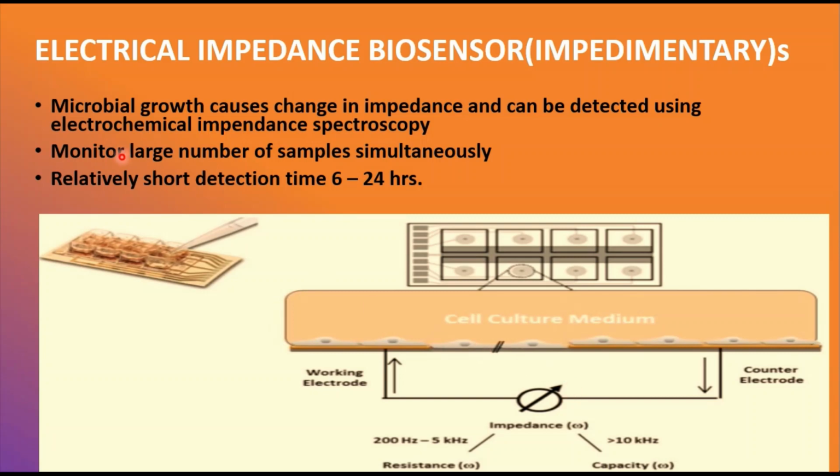So what is meant by impedance? Impedance is the response of an electrochemical system to an applied potential. The frequency dependence of this impedance can reveal the underlying chemical processes in the cells. Once again, electrochemical impedance is the response of an electrochemical system, that is, our cell, to an applied potential. The resistance decreases with growing cell numbers, and the impedance of the growth culture is measured.